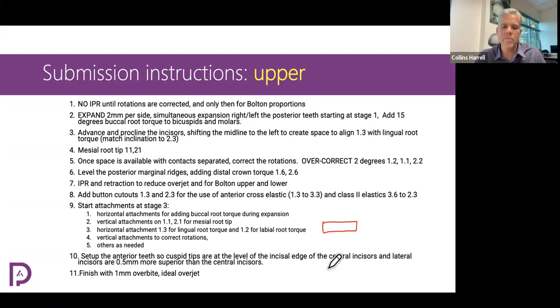It goes on the neighboring teeth that are not intruding to anchor the aligner in place on those teeth so it can exert an intrusion force on the teeth that are intruding. So we use horizontal engagers for extrusions, intrusions, torque, and sometimes for retention of the aligner if they have small clinical crowns. It allows the aligner to snap into place on patients with small clinical crowns.